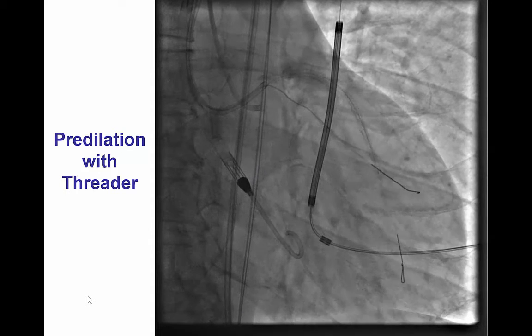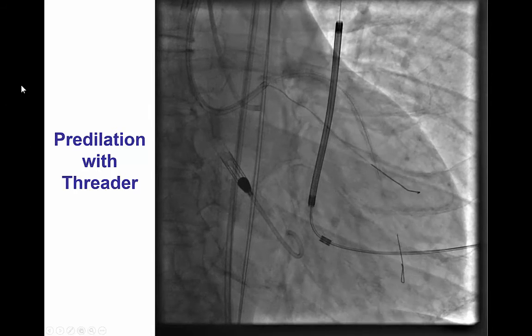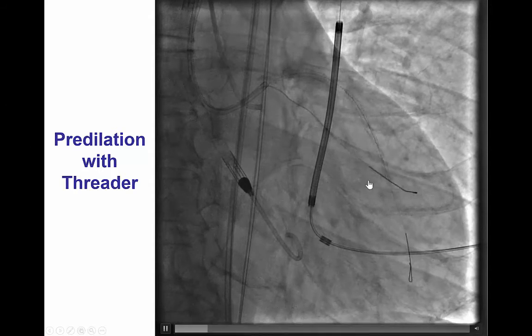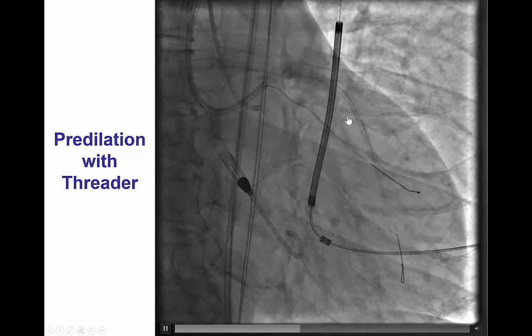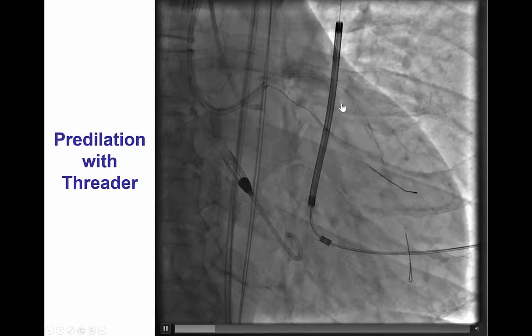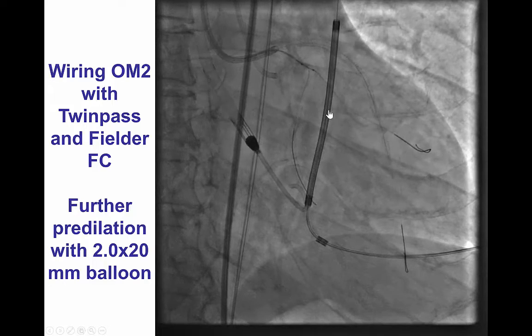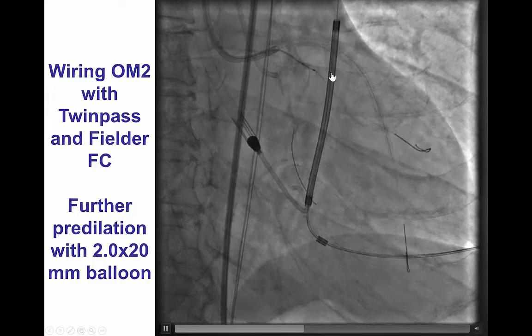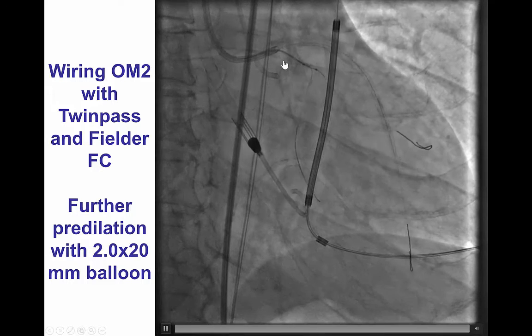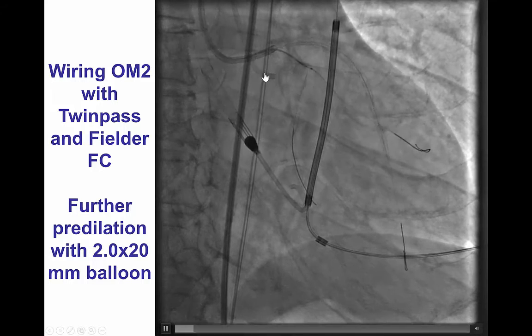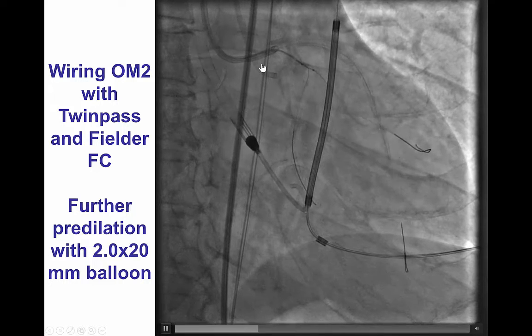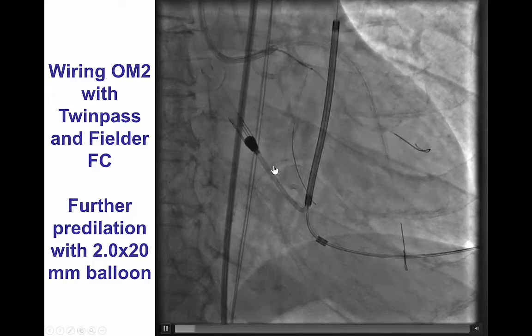The lesion was predilated with the threaded microcatheter, and then we were able to advance a Twin Pass. Of note, before doing anything, we did advance a safety wire in the LAD, because any disruption of flow in the LAD could have been a very serious complication. After we predilated the circumflex, we advanced a dual-lumen Twin Pass microcatheter, and then using a Fielder FC wire, we were able to advance all the way into the distal circumflex.